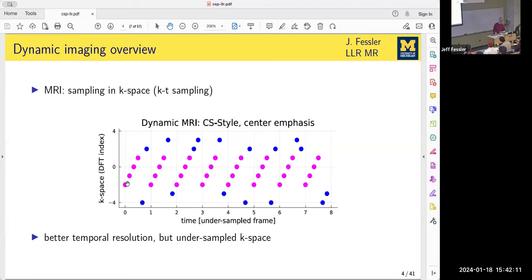You also had a question. Just a quick question. Maybe I don't know exactly how the MRI works, but each bunch of these points, if you do the reconstruction, they should be the same image of the human.